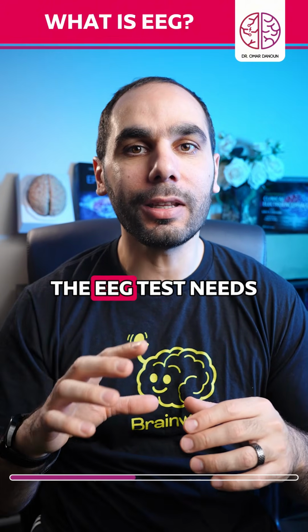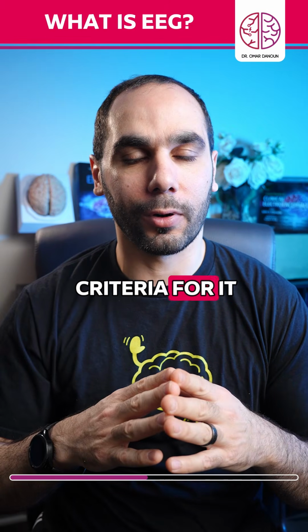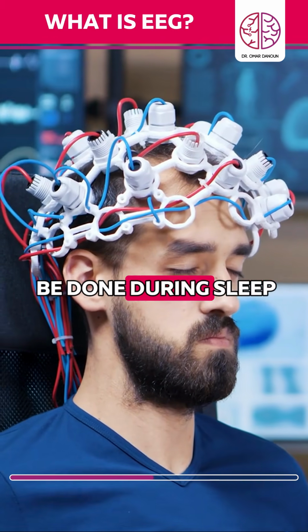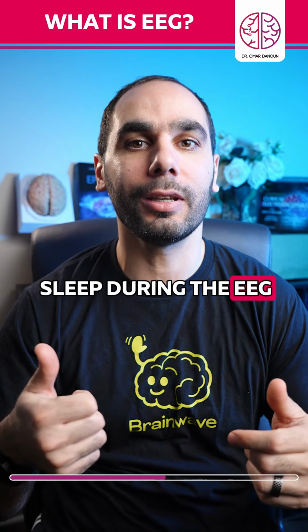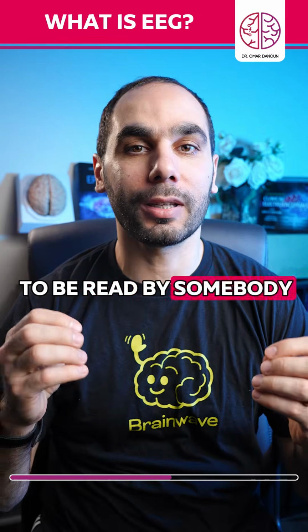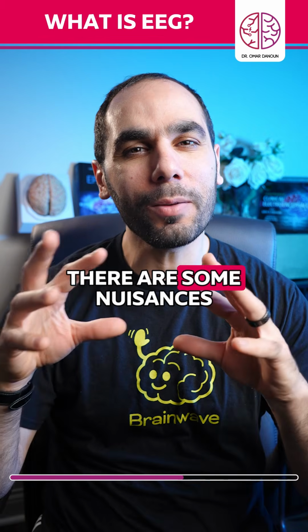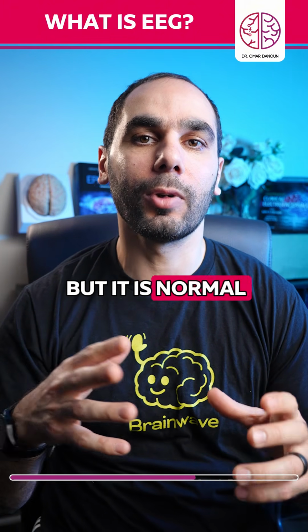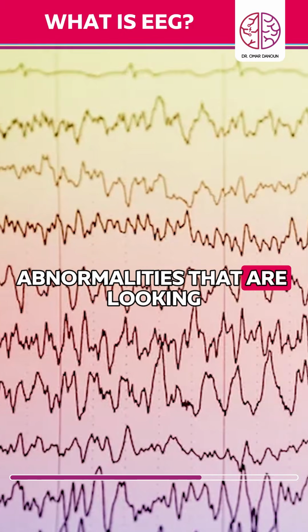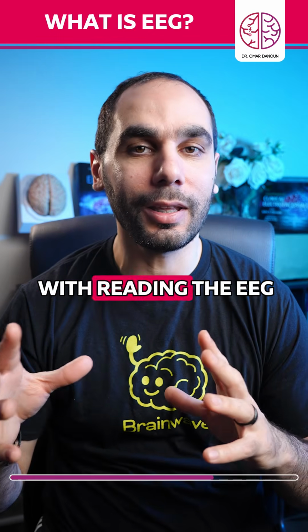However, there are lots of criteria for the EEG test. First, it has to be done during sleep and wakefulness, so it is better to be sleep deprived so that you can sleep during the EEG. Second, it is better to be read by somebody who is experienced in reading EEGs and trained for that, because there are some nuances in EEG that look abnormal but are normal, or sometimes abnormalities that look like normal. So it is important to have good experience with reading the EEG.